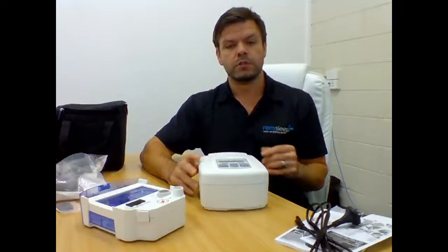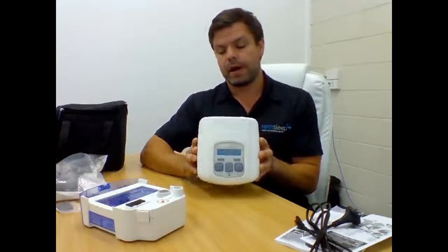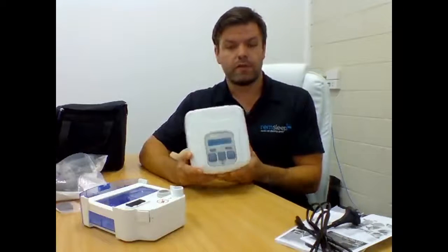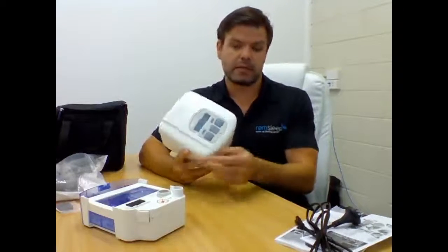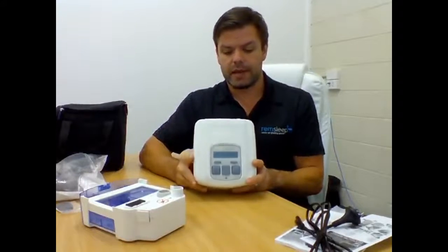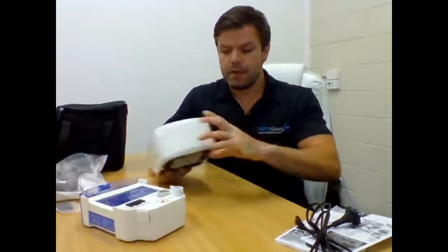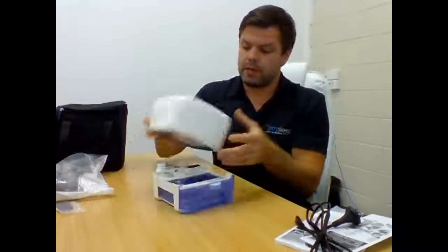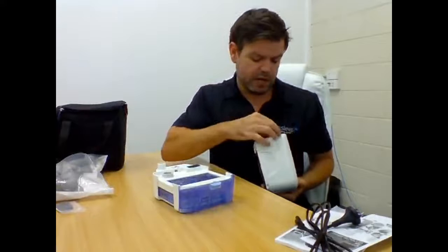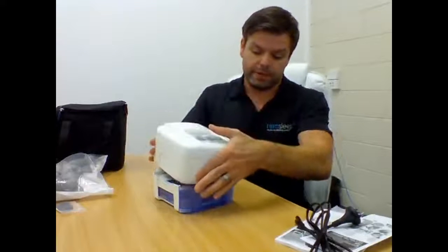So you can use the machine without the humidification, and you do so in events where you want to make the machine a bit more portable. So if you were going to use it with a battery, you'd probably disconnect it. If you were going to fly with it, you'd probably disconnect it, and so on. So that is a handy feature. So I'll just put it back together quickly, and then we can talk about some of the features of the machine and why it's a great machine.